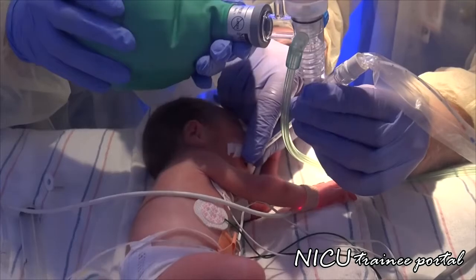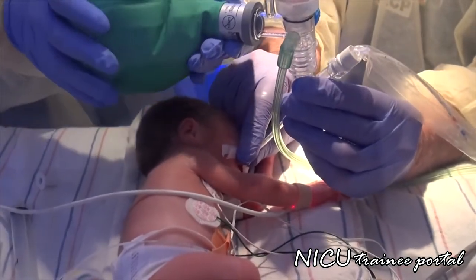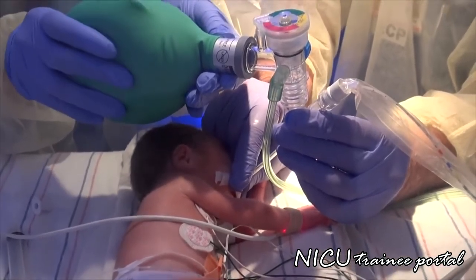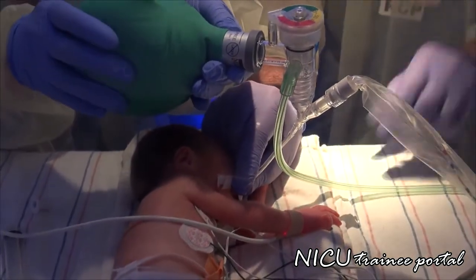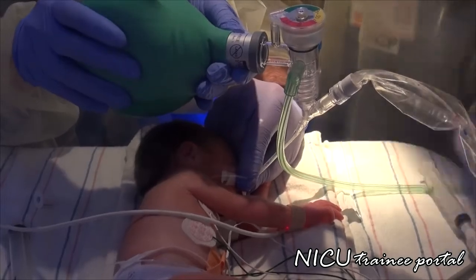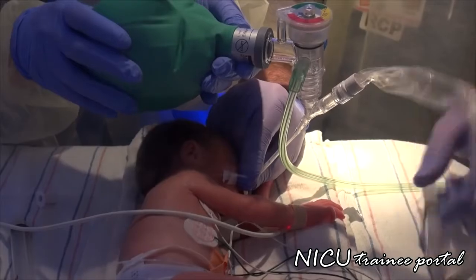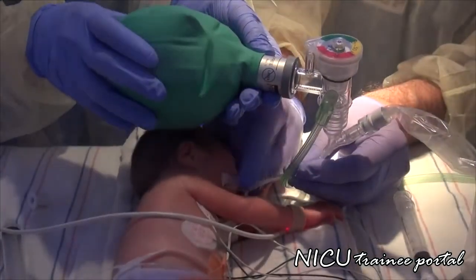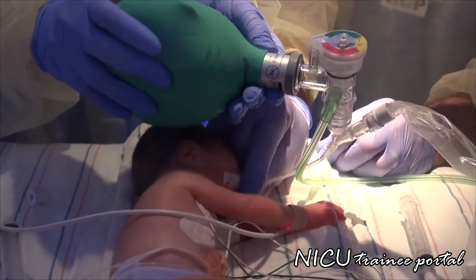I'm gonna do this for about a minute. Nice response. Yeah, that's excellent.